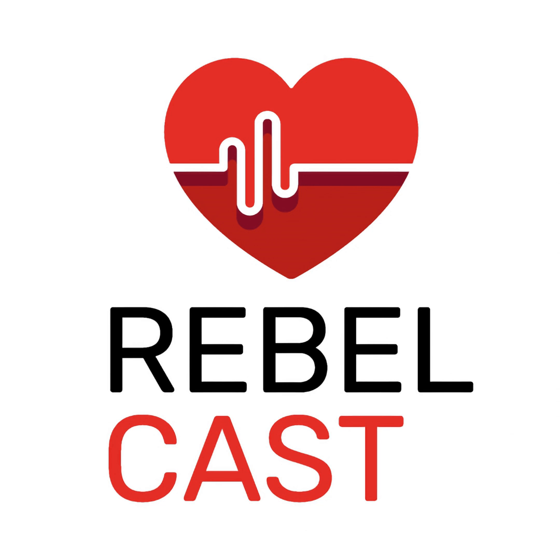Basically, this is a bit of a misconception. A lot of people think it's more like a volume mode because there is a set volume, but we haven't got into flow patterns. There's generally two types of flows. There's a pressure flow, which is a decelerating waveform, very similar to how we physiologically breathe. And then there's a square waveform, which is not how we physiologically breathe, but is seen mostly in volume modes. So if someone's on PRVC, it's a decelerating wave flow.